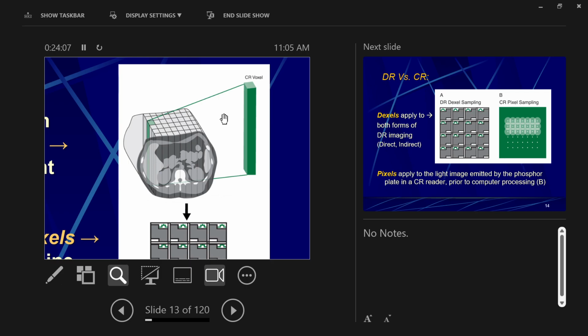Ignore digital for right now. I show you this radiograph, right? Didn't matter what radiograph it was. How many dimensions? Is this a 2 or 3 dimensional thing we're looking at, like the actual image we're seeing? It's a 2-dimensional image, right? It's flat. It has a width and a height.